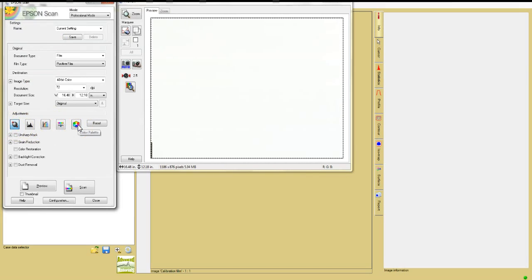It's important that they must be inactive, or else the raw image values will be modified to provide an attractive display with all colors saturated and the brightness and contrast optimized. And for dosimetry, that's quite unacceptable.